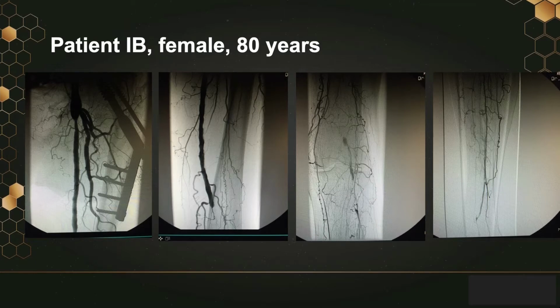I had a look into the operation report, and the vascular surgeon did report that the veins he did use had been of, well, let's say moderate quality, and he had to perform a kind of composite venous graft using the left and right great saphenous veins. Then we see a small segment of reconstitution of popliteal artery in the middle part. And then we have the outflow with diffuse disease of the anterior tibial artery, which was the target for the bypass graft. And we see some refilling of the peroneal and in part also of the posterior tibial artery.